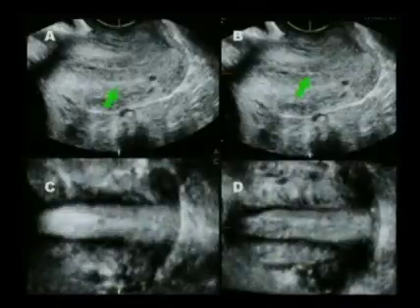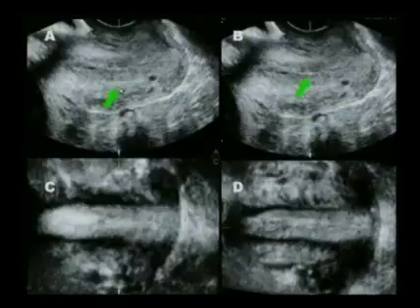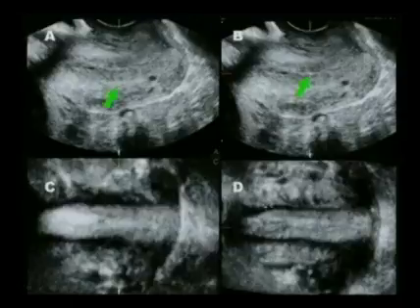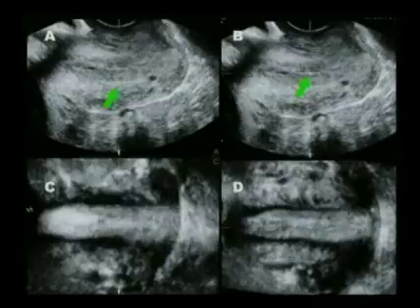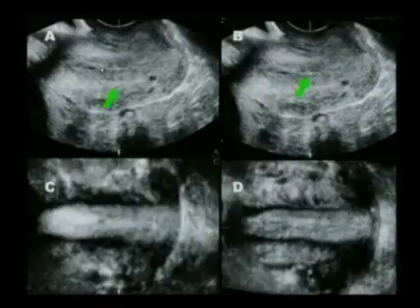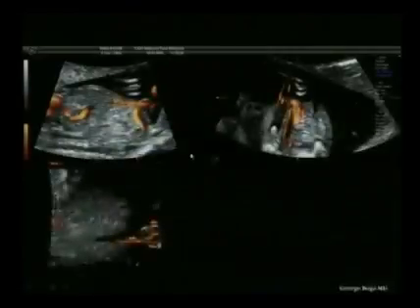Here is another enhancement artifact in the cervix at 21 weeks gestation. As you can see here, the cross-planar point is not put at the cervical canal. This is at the cervical canal. This is a coronal of the cervical canal, a normal one. In this case, here in the posterior lip, we have put the cross-planar point, and we still see here what looks like a cervical canal. This is not the cervical canal, this is the enhancement. This is the enhancement artifact in this case. So this really has to be known.